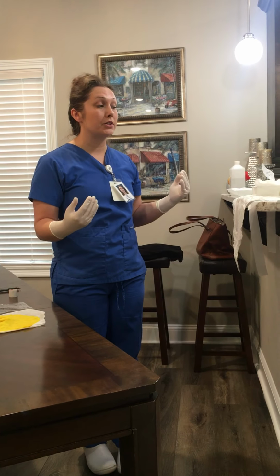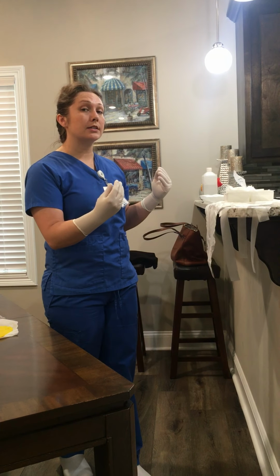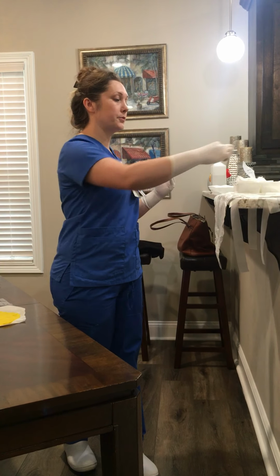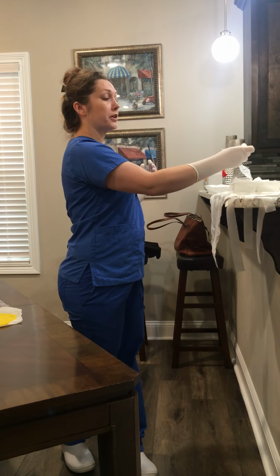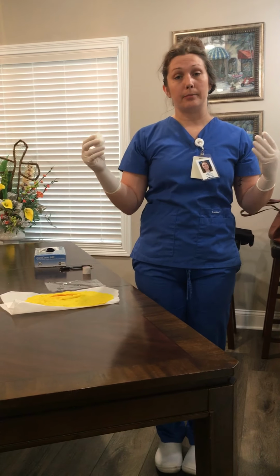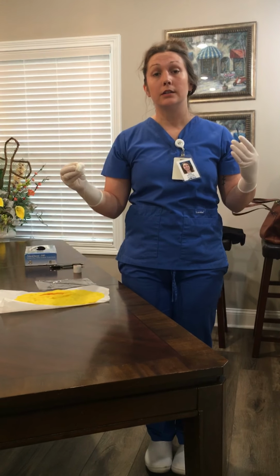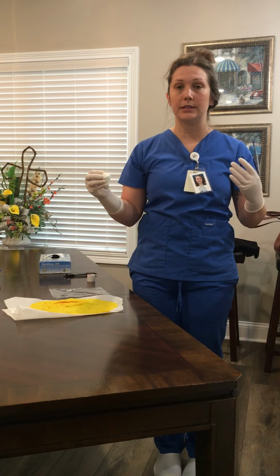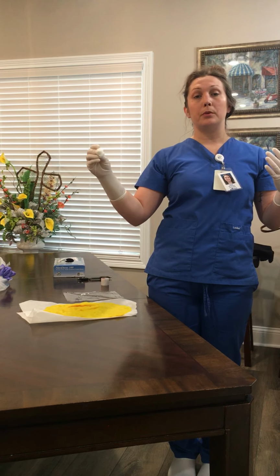So first what I'm going to do is get a piece of 4x4 gauze, and I'm going to wet it in my normal saline. So I'm going to enter my sterile field, grab a 4x4 gauze, get it wet, and now I'm gonna go and clean my wound. Keep in mind that you don't want your gloves to touch the wound at any point because that will contaminate your gloves. And also you wanna start from least contaminated and go to most contaminated.